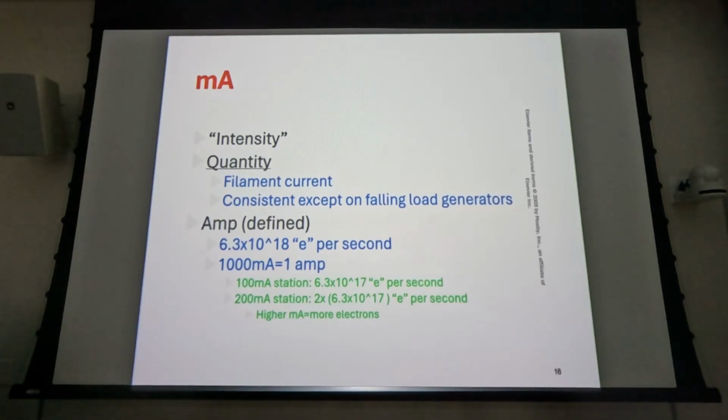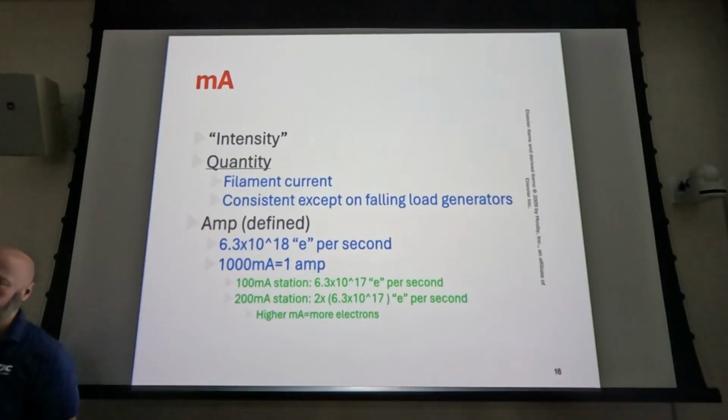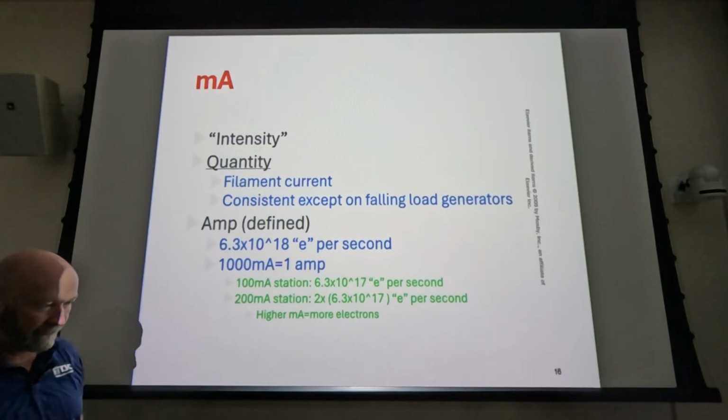Okay, let's start by reviewing what we talked about on Wednesday. So we talked about MA, what it controls in the X-ray tube. Of course, it just controls the heating of the filament. Let's step back to kVp for just a second.